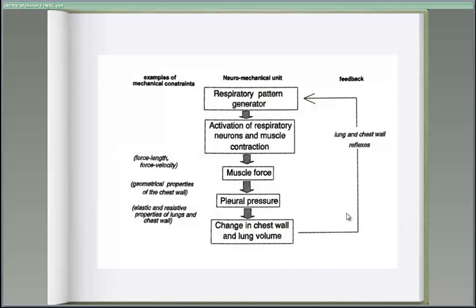Now, certainly there's been some negative information about spontaneous breathing, especially early in ARDS. In our clinical experience, we don't see that, but primarily we use APRV as the mode of spontaneous breathing. And other modes may not offer the same protection that you might have with APRV. The reason might be that ventilation is actually much more complicated. In fact, in the Handbook of Physiology, at least 400 pages are dedicated to the control of breathing. So it's beyond the simple notion of transpulmonary pressure.